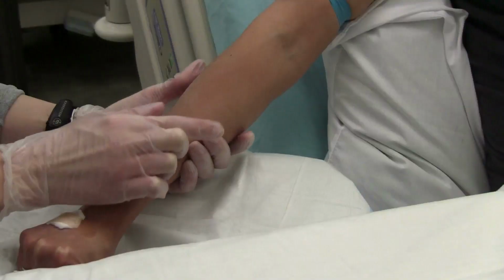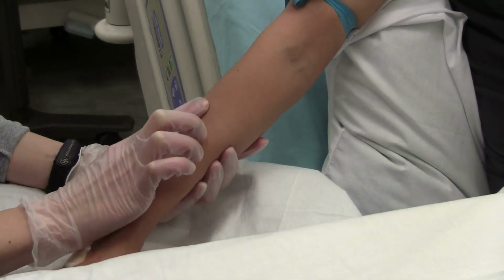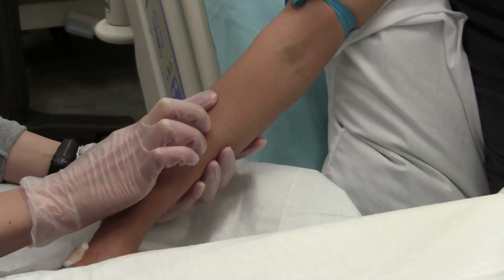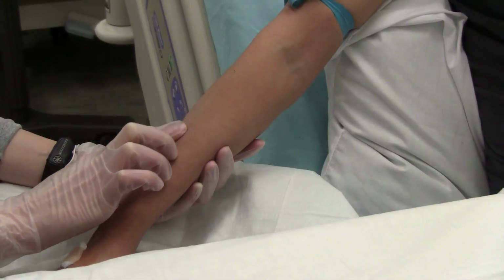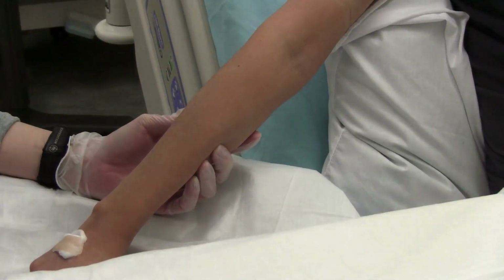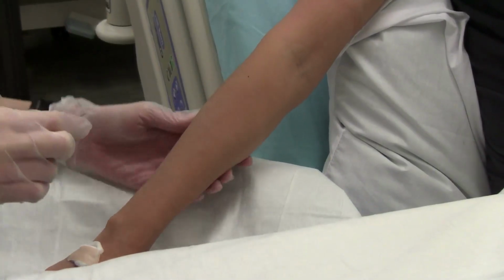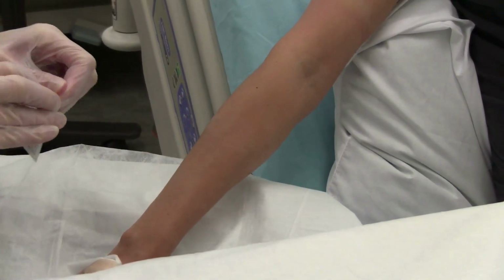And expose the limb that you are going to use, but make sure that you are still providing privacy for the client. Select your venipuncture site. Use the patient's non-dominant arm if possible. Identify possible venipuncture sites by looking for veins that are relatively straight.